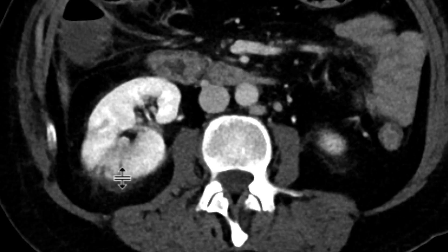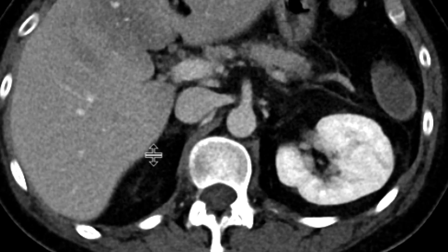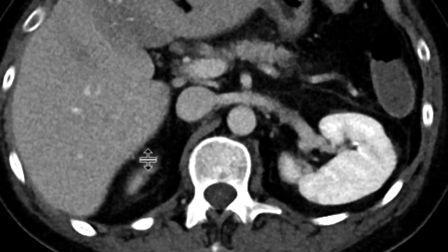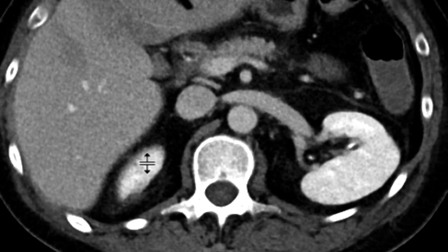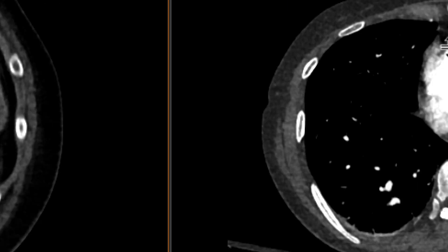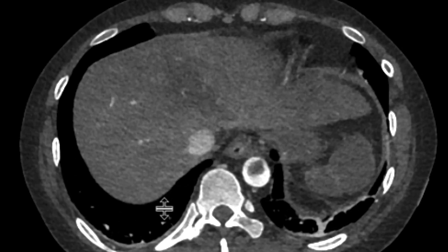There are some areas of linear and wedge-shaped areas of decreased attenuation, and so clearly there's something going on that's affecting multiple organs — certainly splenic infarcts. In that context, the kidneys are likely going to be renal infarcts.